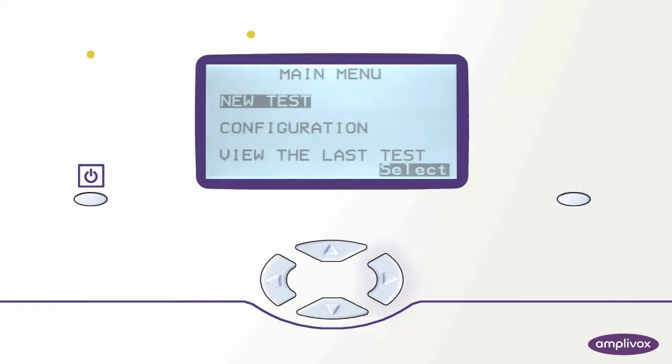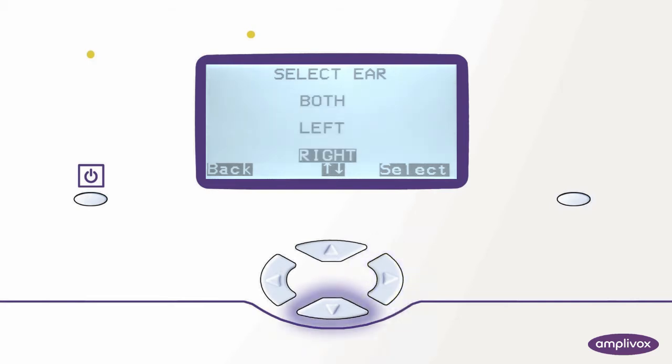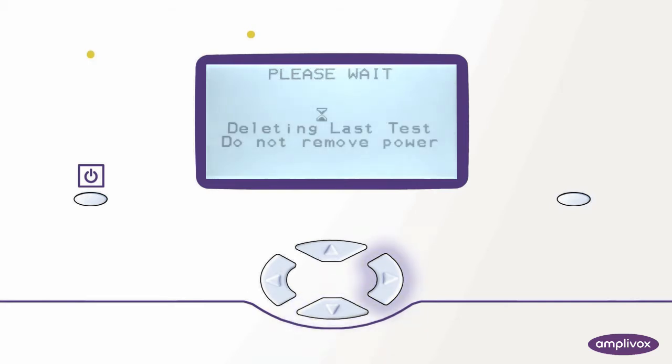From the main menu select the right key to start a new test. As soon as the earset selection is made, the probe check will start automatically.